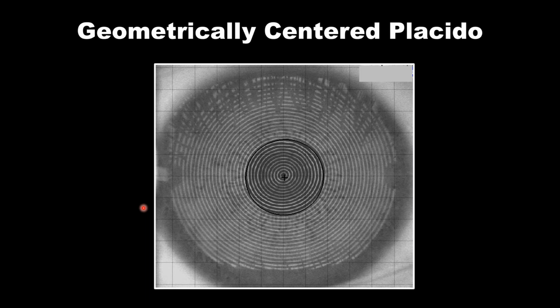When you think about how you evaluate all your contact lenses through the slit lamp, of course, we never know what the visual axis is. We look for centration in relationship to the visible iris diameter. And the same thing is true when we construct the lens. We're assuming the eye is symmetric in shape, and therefore we should be building the contact lens off a symmetrically captured topographer.